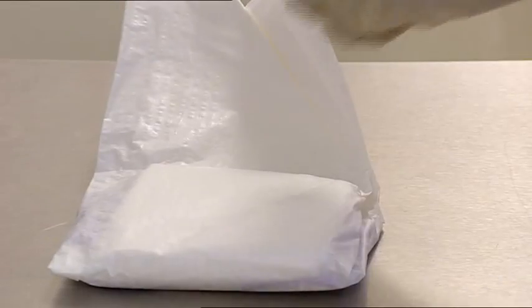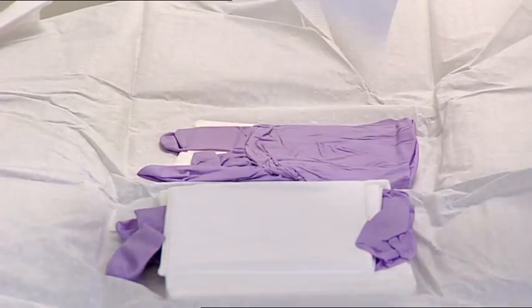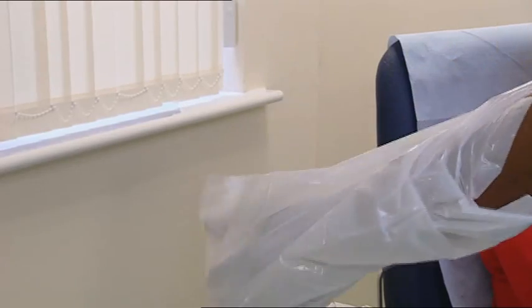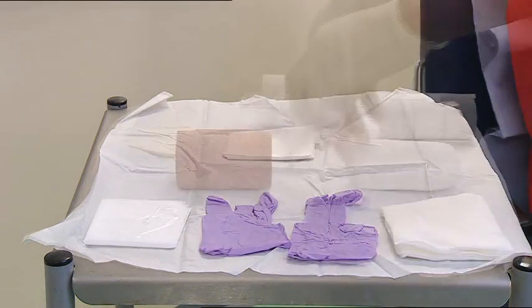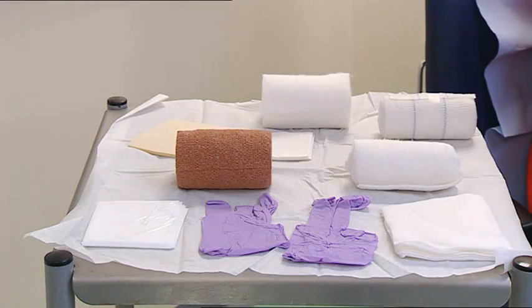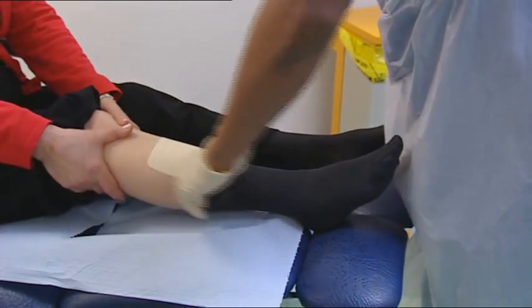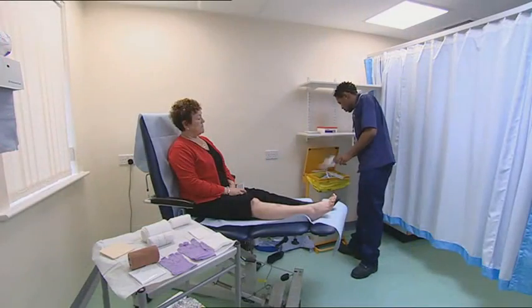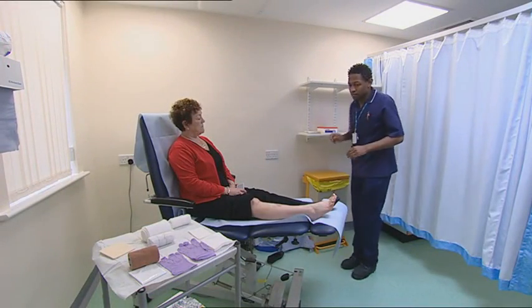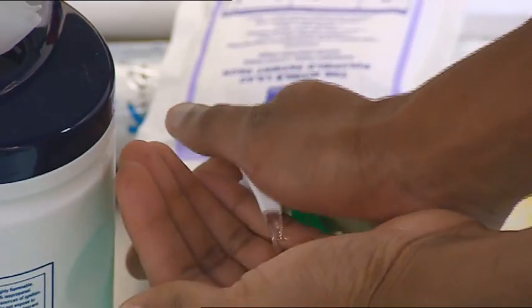Open the pack, being careful to touch the outer corners only. Use the plastic waste bag contained in the pack to arrange the contents on your aseptic field. Ensure that everything you'll need to dress the wound is arranged on the aseptic area before removing the patient's used dressing. Once the dressing has been removed and safely deposited in the waste, along with your apron and non-sterile gloves, hands must be decontaminated before putting your gloves on.